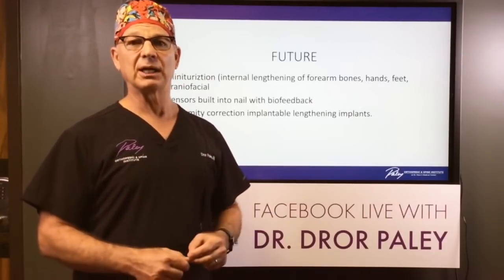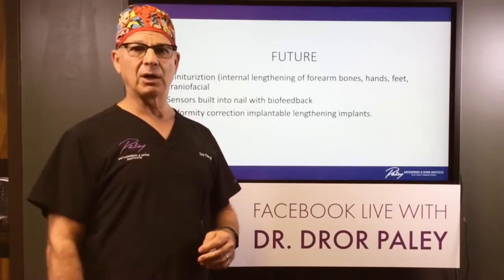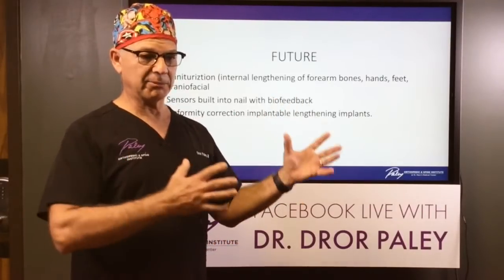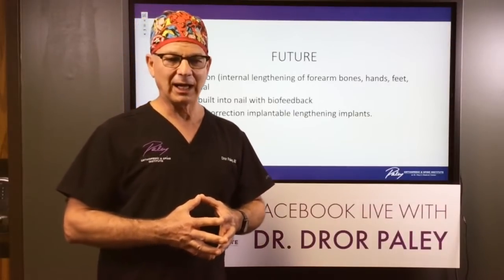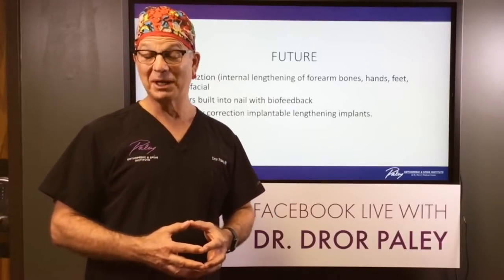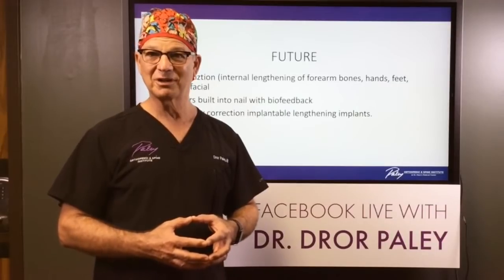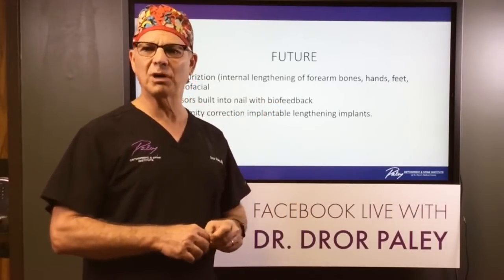But I'll tell you what we're going to see in the next 2 to 3, even 5 years, which is exciting enough. So in the device field, we're going to see miniaturization. We're already seeing that. We're going to see devices for lengthening get smaller and smaller, to the point that they can lengthen a metacarpal bone, a foot bone, a finger, a toe, small enough that someone with a recessed jaw can have 2 of these devices put on and lengthen the jaw. They can move, some kids born with all kinds of birth defects of the eyes, the orbit, and the mandible. They can move all those bones around. They can expand the cranium, for kids who are born with all kinds of defects in the skull. Those are just bones.